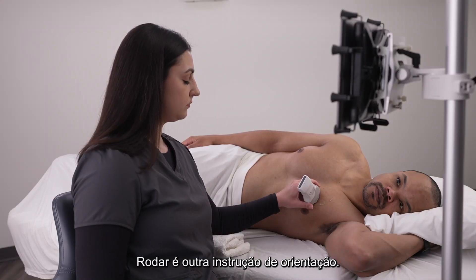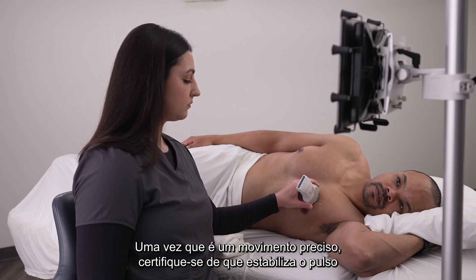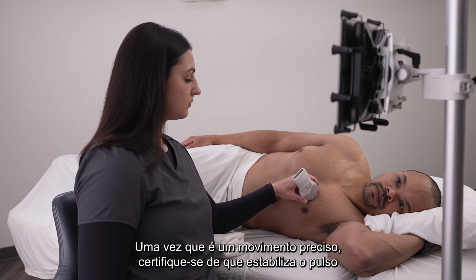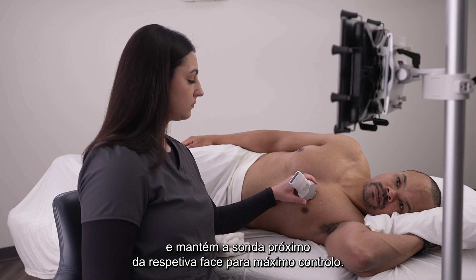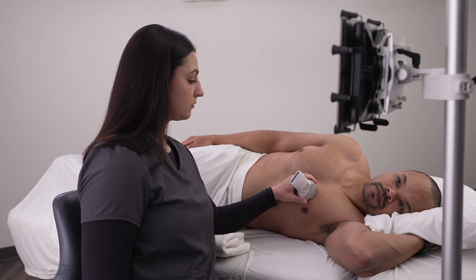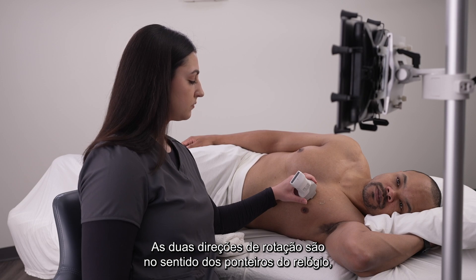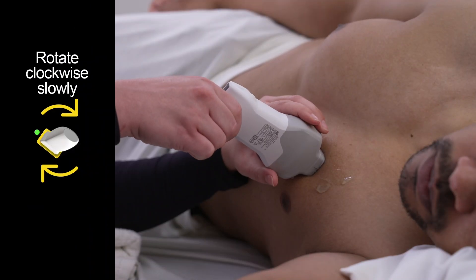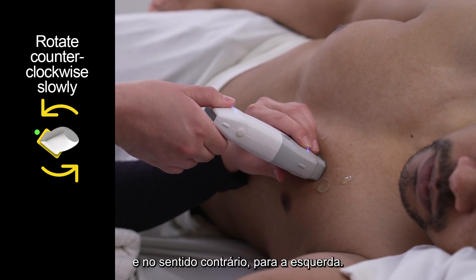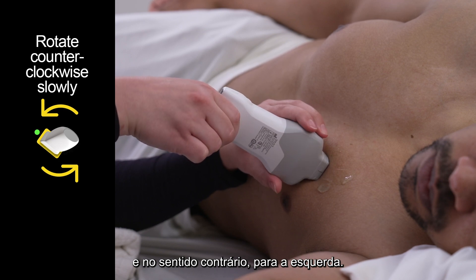Rotate is another guidance prompt. Since it is a fine movement, make sure to stabilize your wrist and hold the probe close to its face for maximum control. The two directions for rotating are clockwise, or to the right, and counterclockwise, to the left.